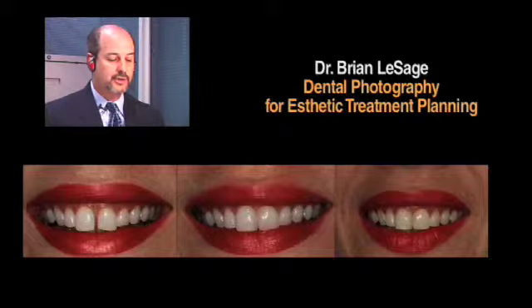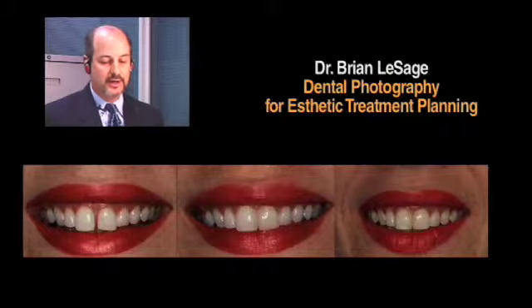If you look at the inner commissure line, it is slightly at an angle. And if you look at the midline, it looks like it could be off here, but it's only because of the angle of the camera. And so as I take the correct angle and line up the inner commissure line with the horizon, then you can see the midline is perpendicular to that, which is what we want, and we have good axial inclination.